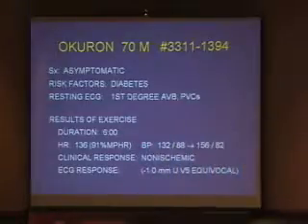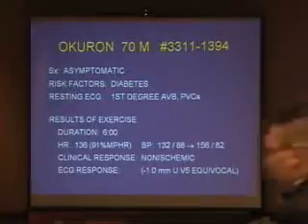Another patient from our study, 70-year-old doctor who's diabetic, comes in for a nuclear scan, and his scan wasn't quite so normal.